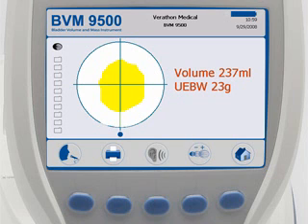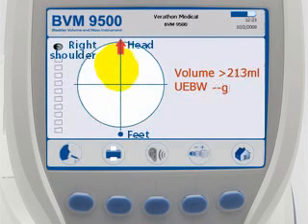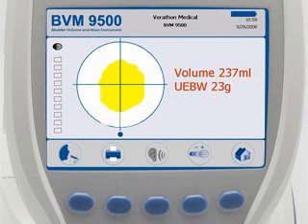The patient's bladder volume must be between 150 and 400 milliliters to ensure an accurate measurement of UEBW. If the patient's bladder volume does not fall in the 150 to 400 milliliter range, UEBW will be blank. After you have verified an accurate scan, you may select from the following options.